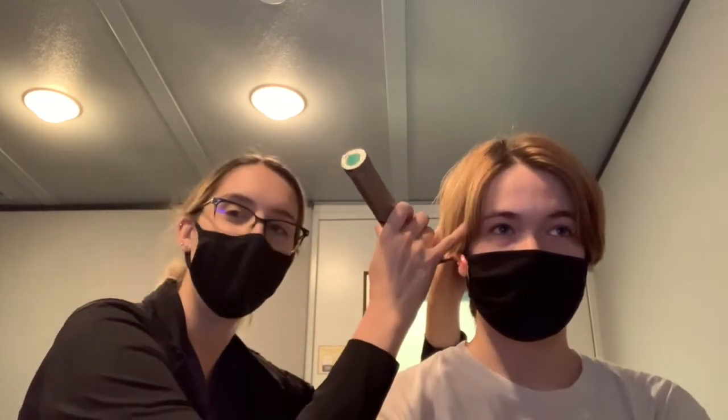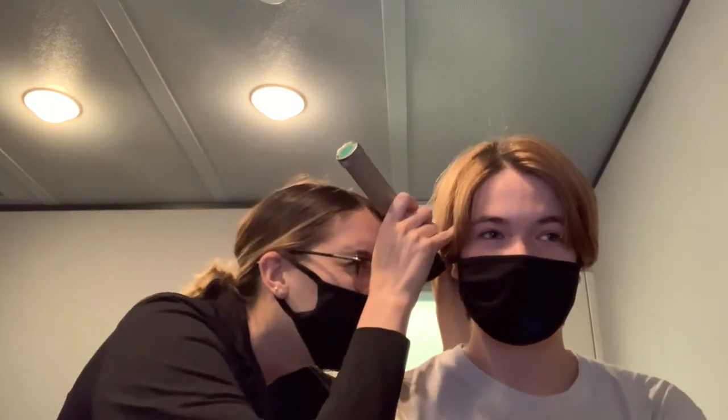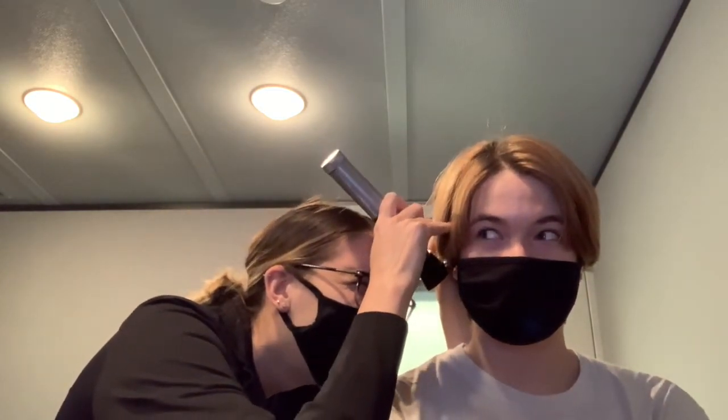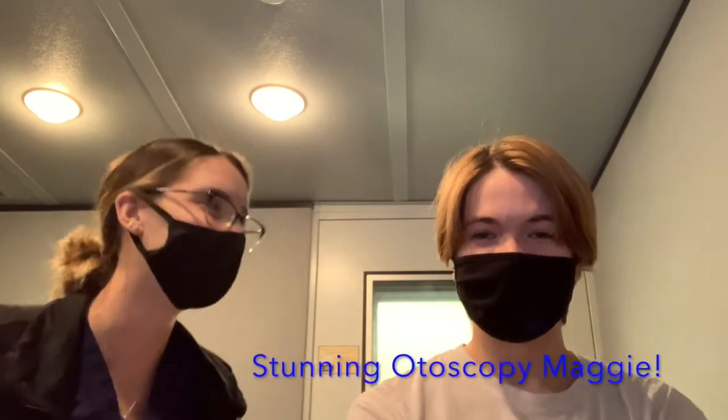Yay! So I turned it on. And on the client's head, you're going to want to pull their pinna up and back. And then you're going to want to brace with your other hand as you look in their ear, just in case their head moves around. And then look in. And I can clearly see all of the landmarks on the tympanic membrane. Beautiful. Okay, now that you're done with otoscopy and everything looks clear, you're ready to move on with testing.